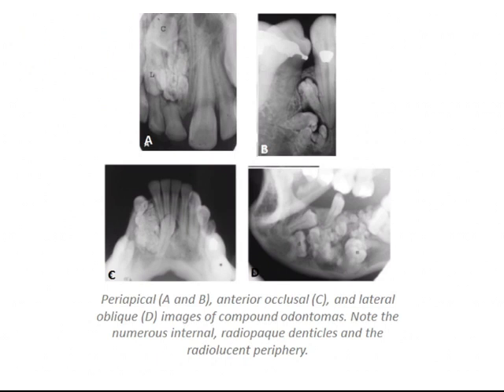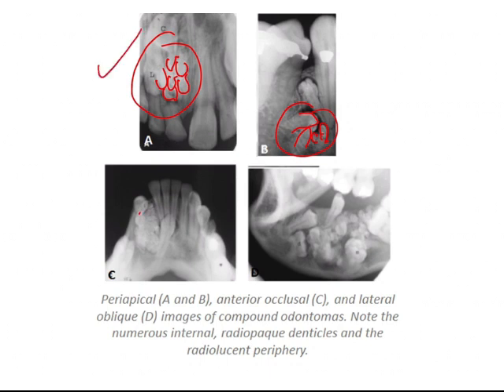Now we will see images — very important. The more images you see, the clearer your concept gets. This is an anterior occlusal and lateral oblique image of compound odontoma. You can appreciate several malformed tooth-like structures here. It is located in the anterior maxilla.